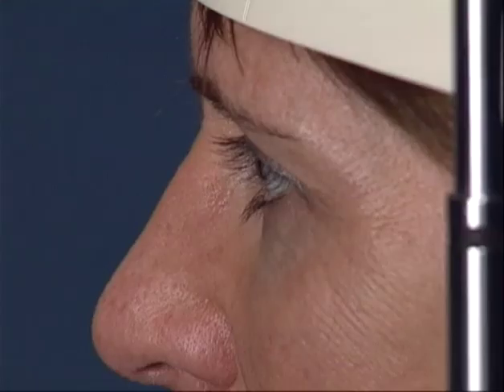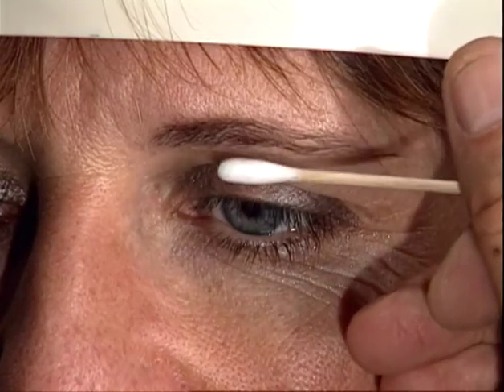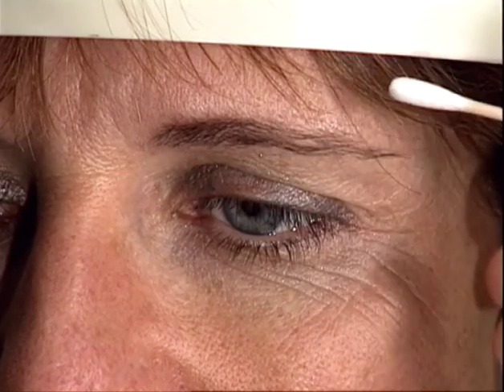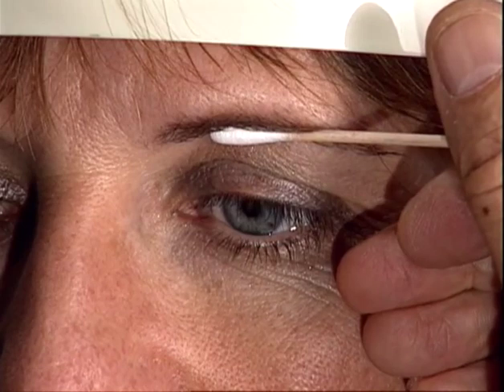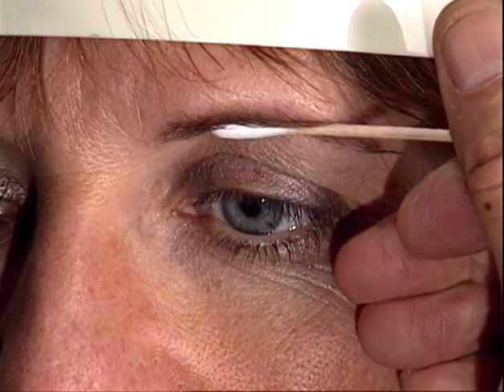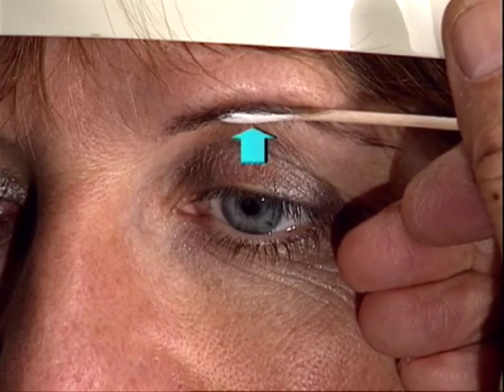When retracting the eyelids, the main task of the examiner is to avoid any force vectors in direction of the orbital contents. This is no problem in the cooperative patient. In a difficult case, a cotton tip applicator may be used, which, to avoid force vectors towards the orbital contents, is not applied at the lid directly, but at the orbital margin, that is, just beneath the eyebrow. Pressure is not applied in direction of the orbit, but away from the orbital contents towards the bone of the orbital rim. But how is it then possible to retract the lid?